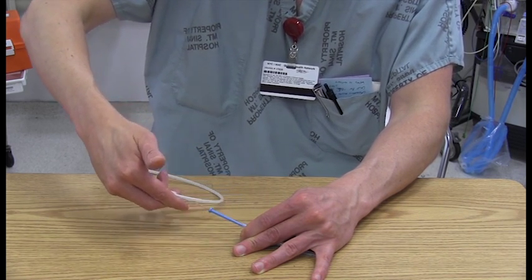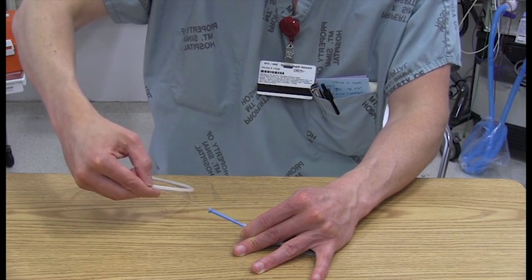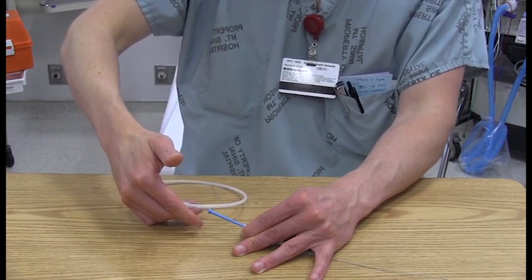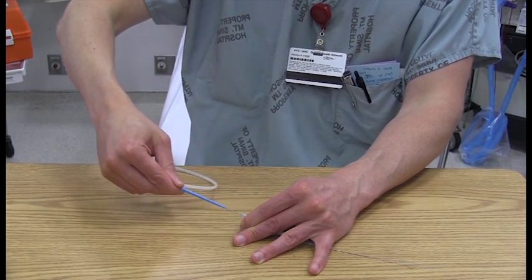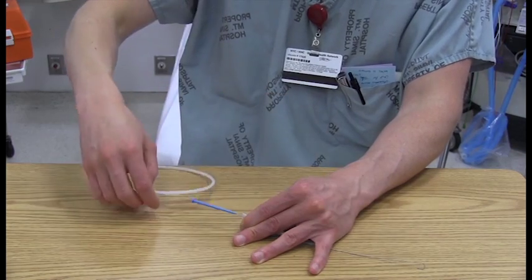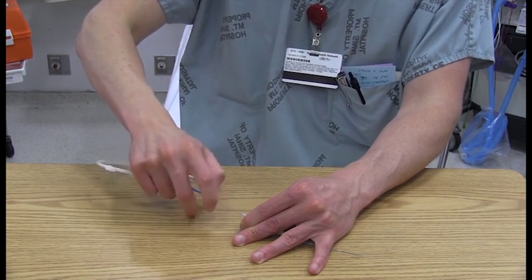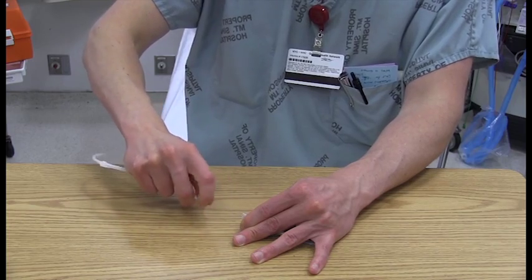Now the next move is to pull back on the entire apparatus. Then re-grab with your thumb and index finger, and again push forward. Pull back, push forward. If you need to withdraw the wire, which is always fraught with peril, but if you decide it's a good idea, then you'll pull back and then advance the whole apparatus. And there'll be some friction in a real patient, so this will not go back into the patient. And you can just keep doing that until the wire is now back into your initial wire thing.